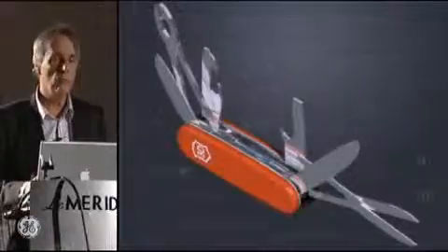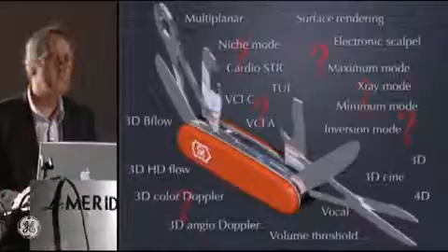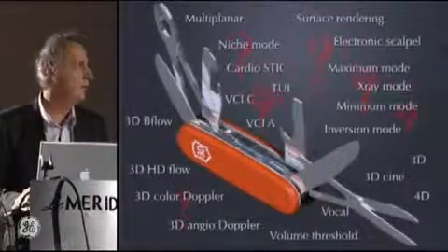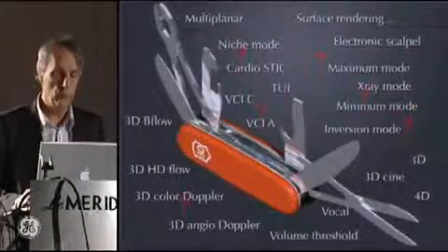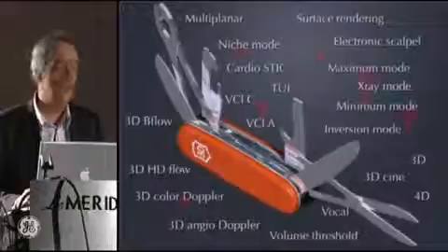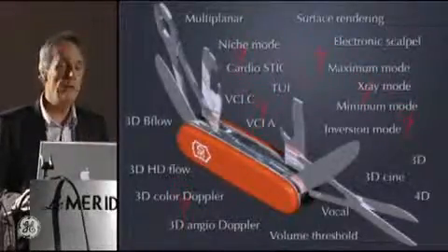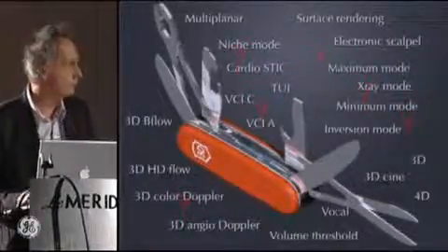But the problem with 3D is it's a tool, a Swiss knife of ultrasound, but you have many tools, and it is really difficult to find a good tool. First, you have to know all these tools. Second, you have to know how to use this tool. And third, you have to know when you have to use this tool. But it's not so difficult.